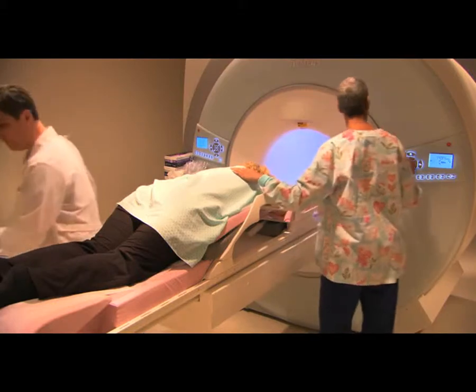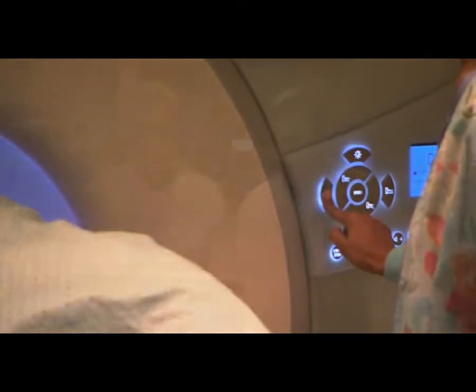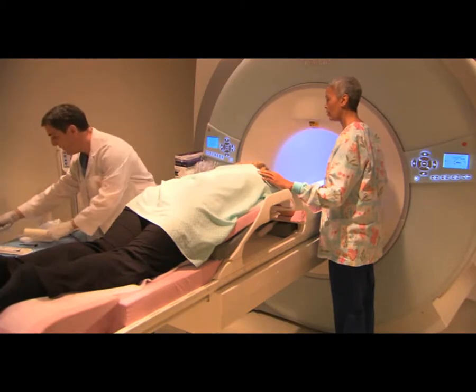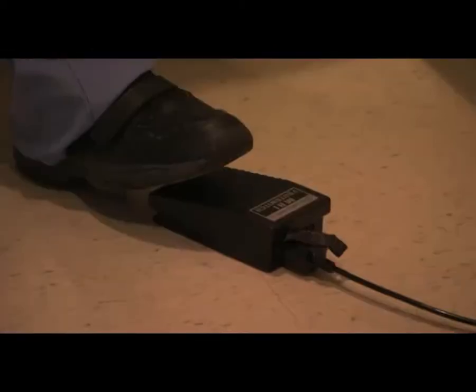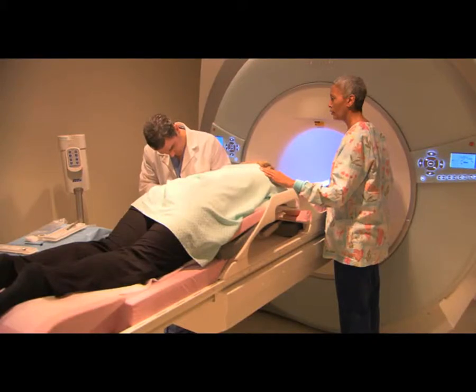Then it's back into the magnet for a set of confirmation images. At this point, the physician has targeted the precise point in the breast where the biopsy needs to be taken, and positions the biopsy device to take the tissue sample. When the physician begins the biopsy, you'll hear a sound and you may feel some pressure.